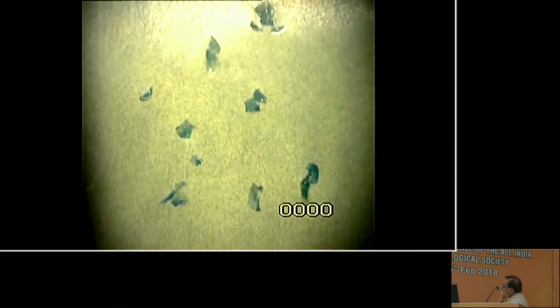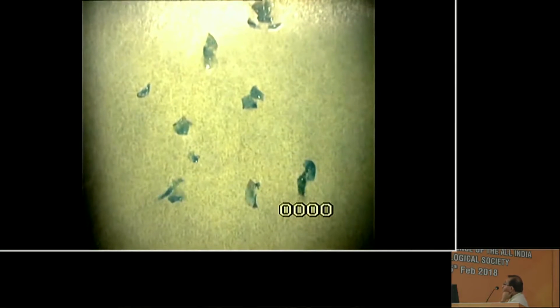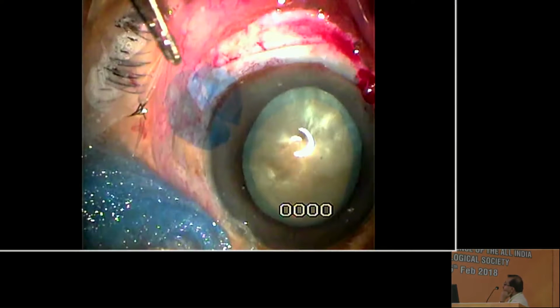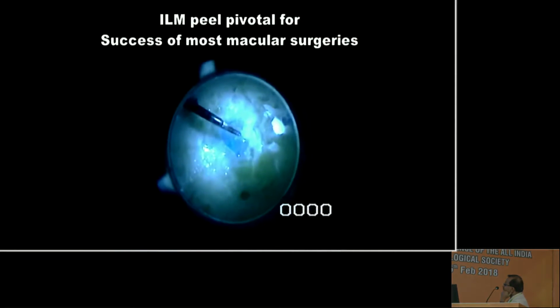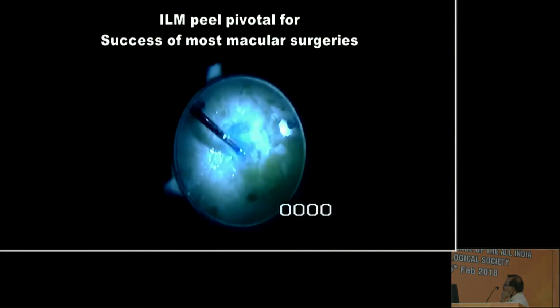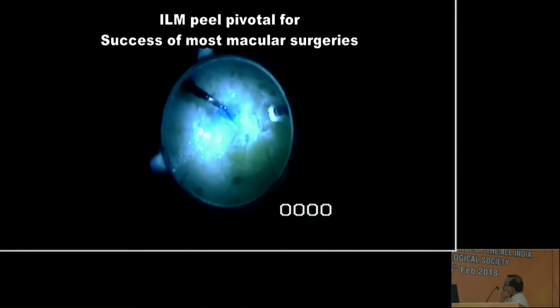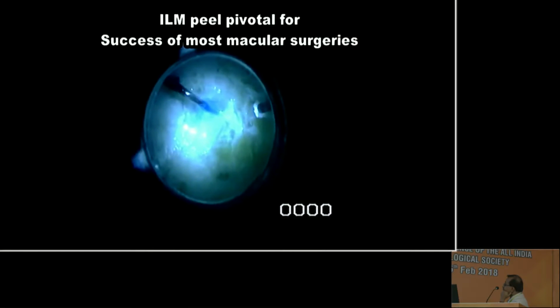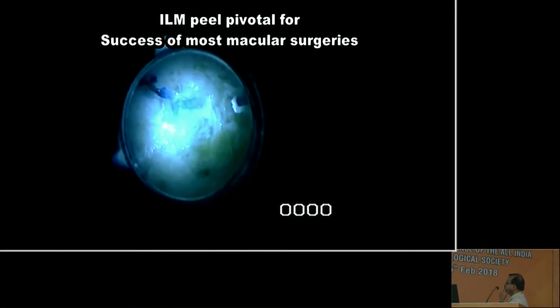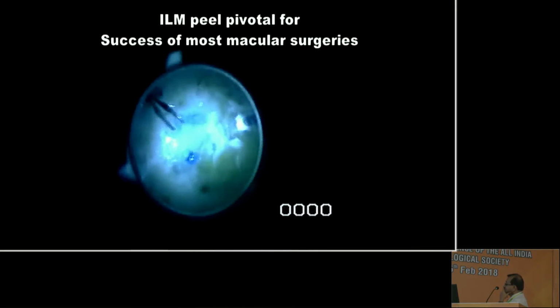Trypan blue stained anterior capsular fragments during cataract surgery may be retrieved and used as an ILM to simulate ILM peeling. Both the lens capsule and the ILM are made of type 4 collagen and have an elastic consistency. Thus, the lens capsule is a good substitute to learn ILM peel.